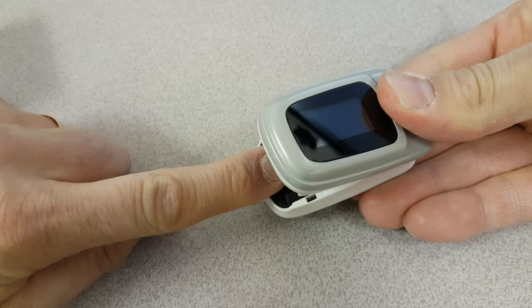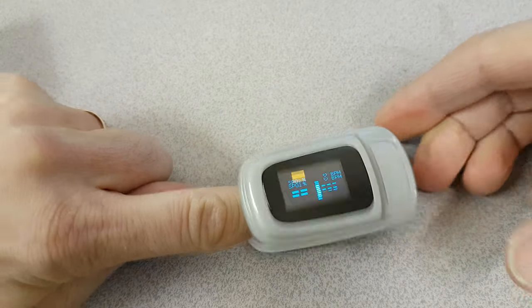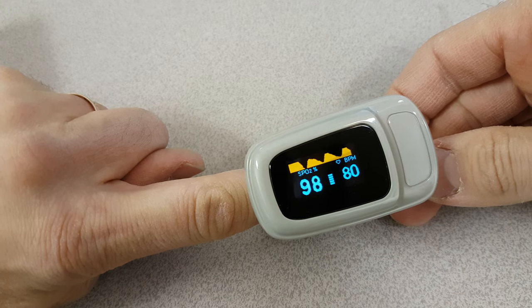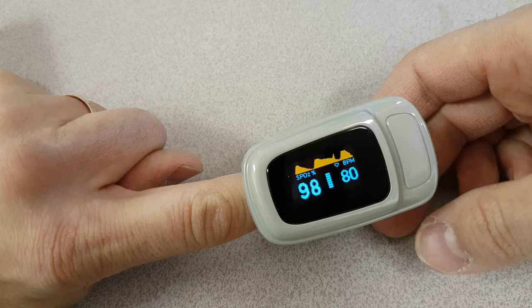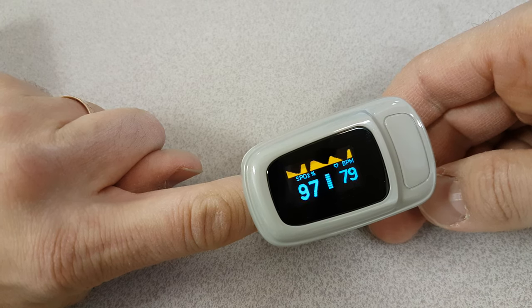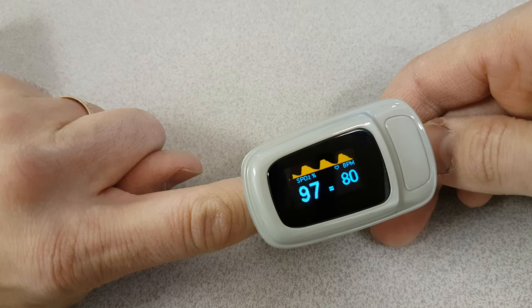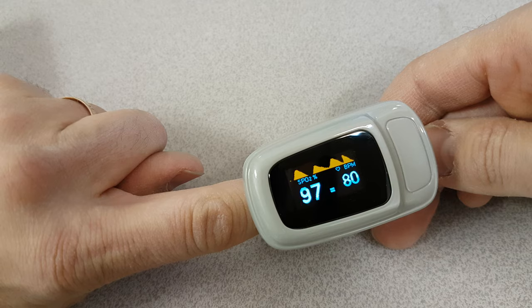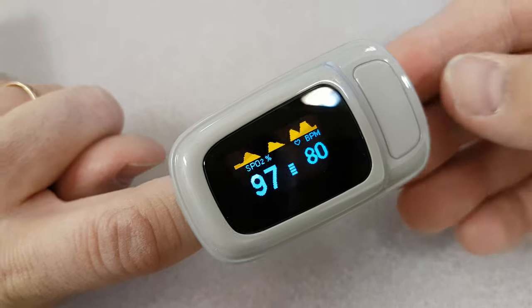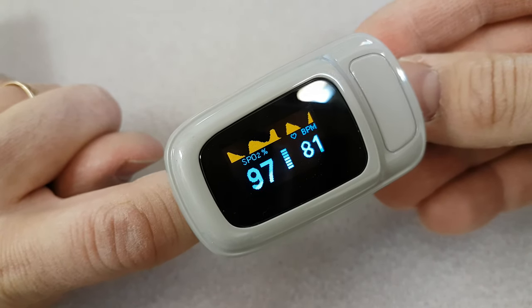You open it up and put your finger in. It has an infrared beam sensor and a light sensor. The combination of these things allows it to measure your beats per minute, your heart rate, and the SPO2 percent, which is the oxygen saturation in your blood.